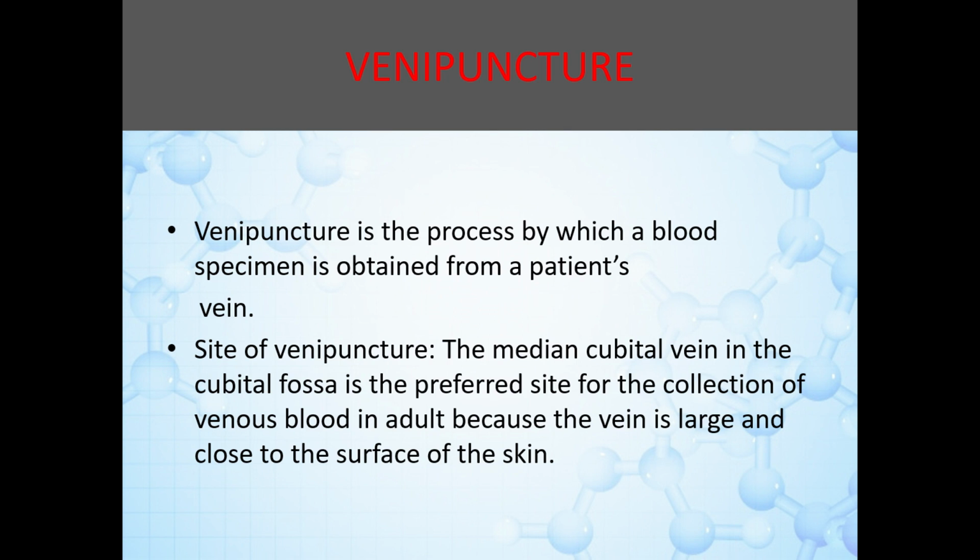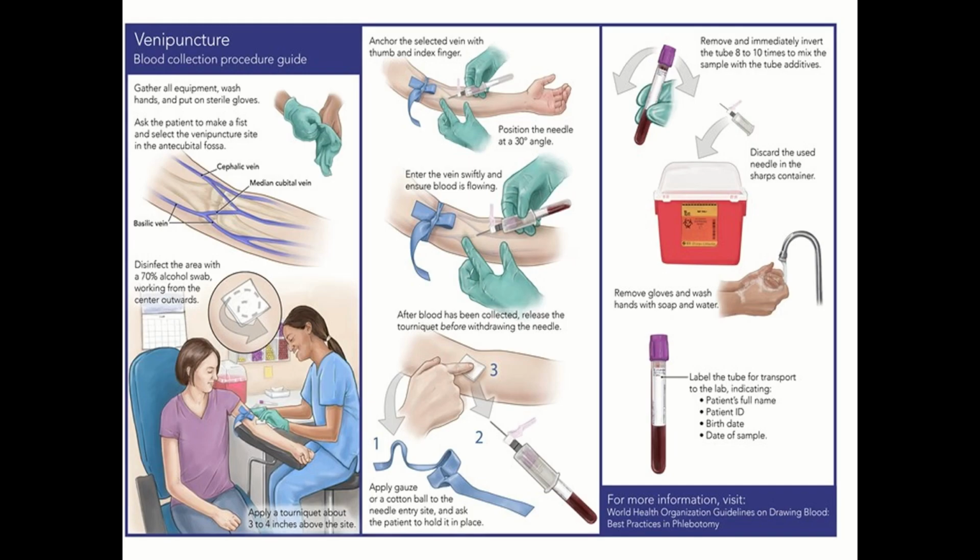Now, here in this picture, the entire procedure of venipuncture is given, and you can see all the minor details.